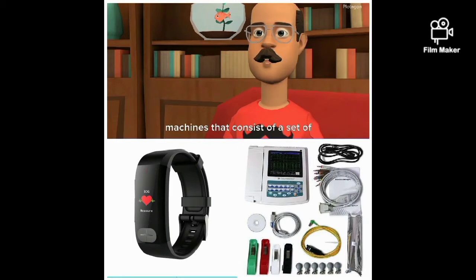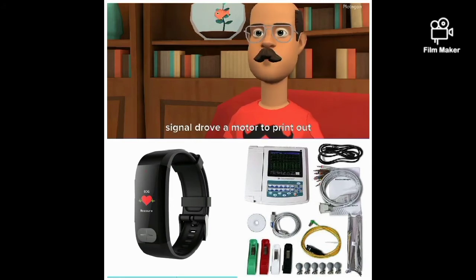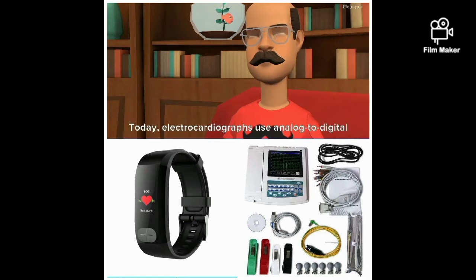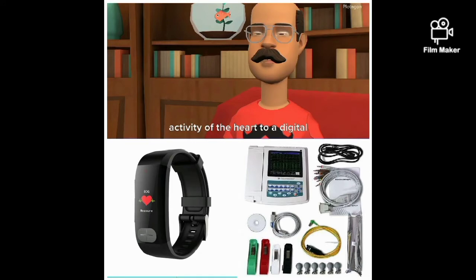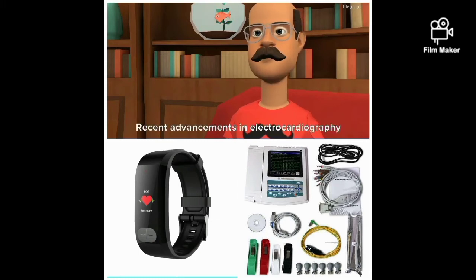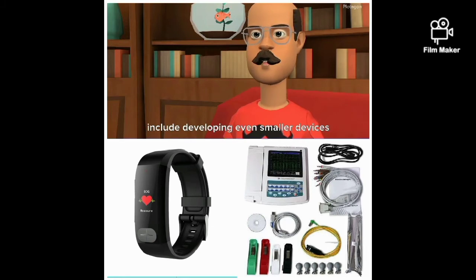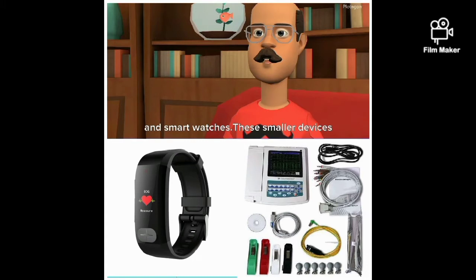Electrocardiograms are recorded by machines that consist of a set of electrodes connected to a central unit. Early ECG machines were constructed with analog electronics, where the signal drove a motor to print out the signal onto paper. Today, electrocardiographs use analog-to-digital converters to convert the electrical activity of the heart to a digital signal. Many ECG machines are now portable and commonly include a screen, keyboard, and printer on a small wheel cart. Recent advancements in electrocardiography include developing even smaller devices for inclusion in fitness trackers and smartwatches.